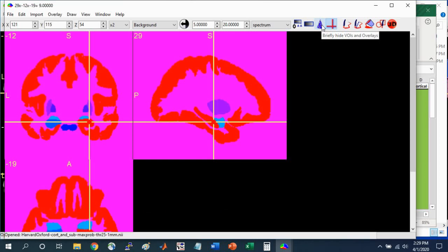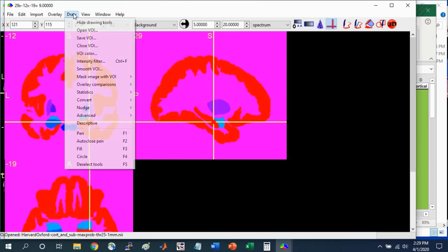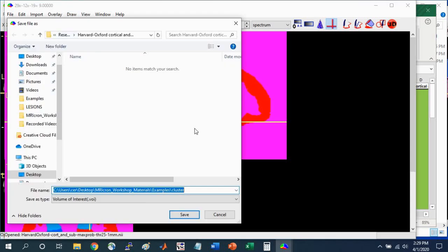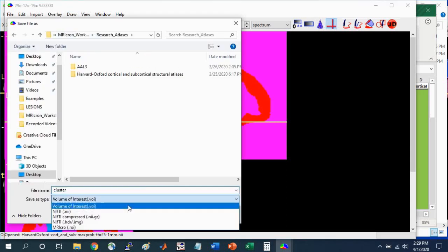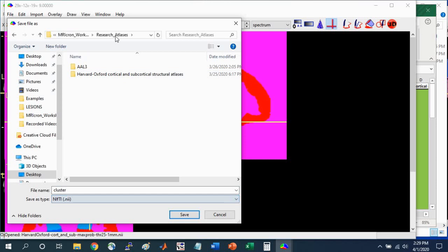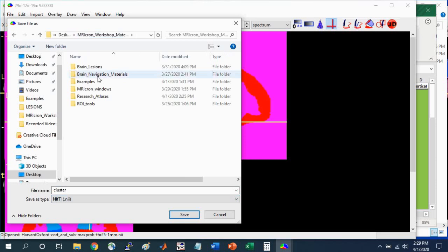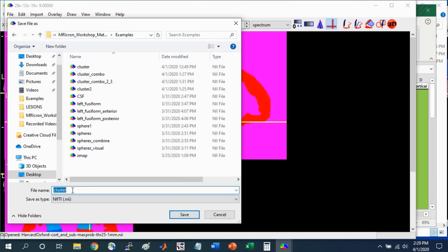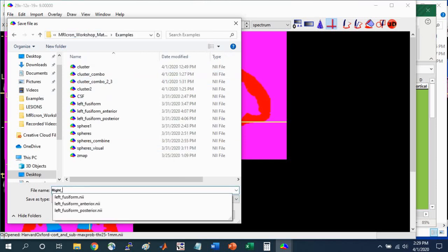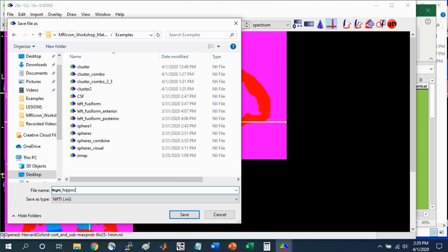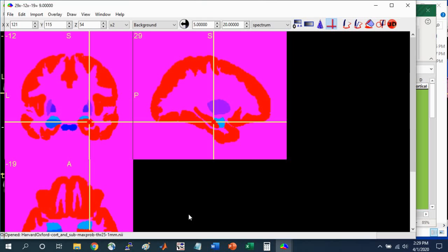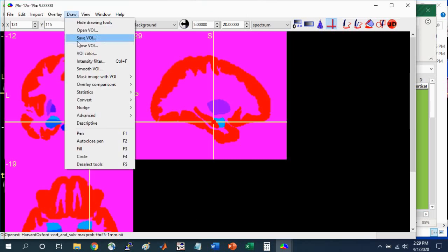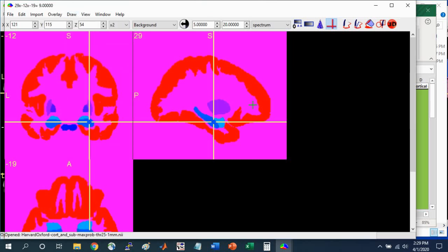Now we have a nice hippocampus region of interest, also called volume of interest. We can go to draw, save VOI, to save that. I'm going to save it into my examples folder. I'll just call it right hippocampus. I like to save things in the nifty file format. Save that. And draw, close VOI to get rid of it.